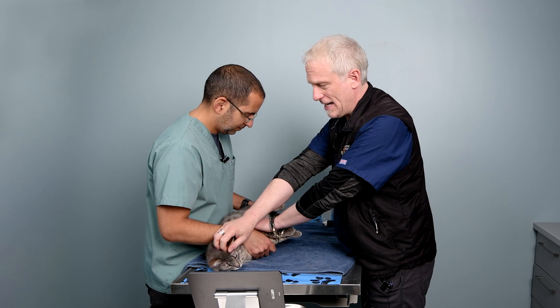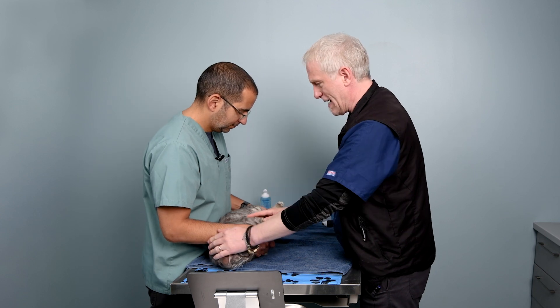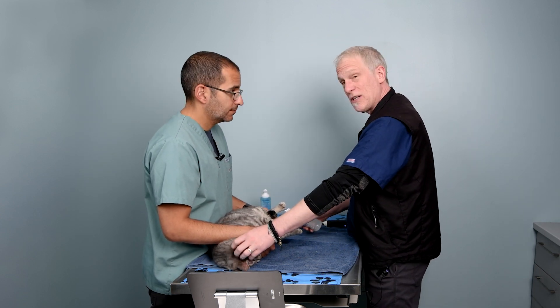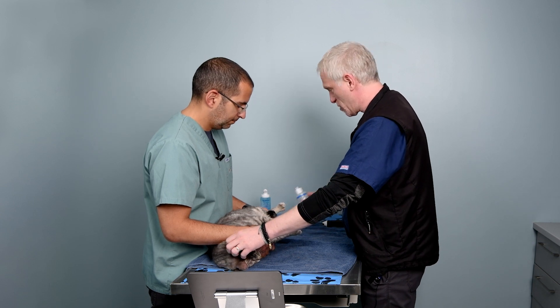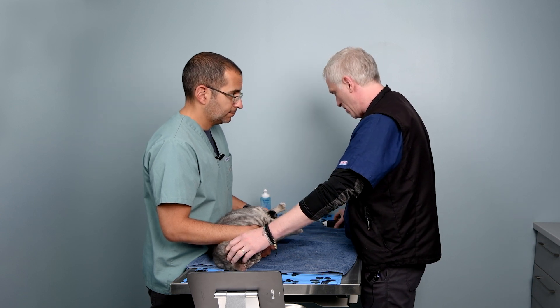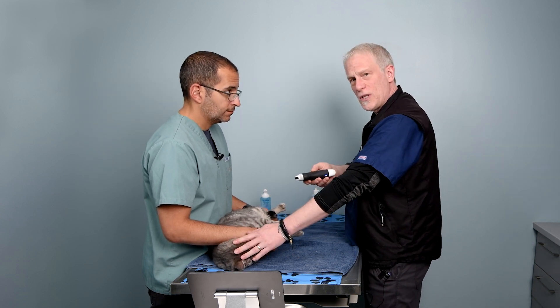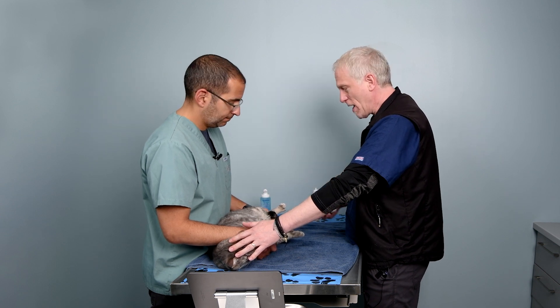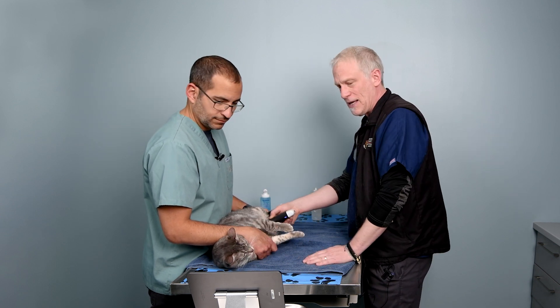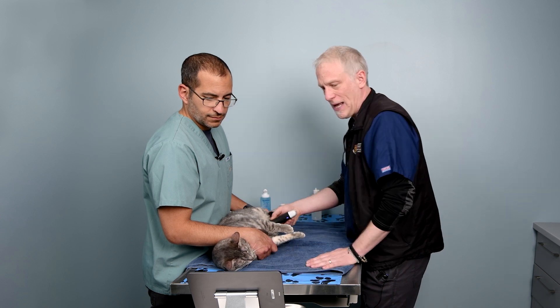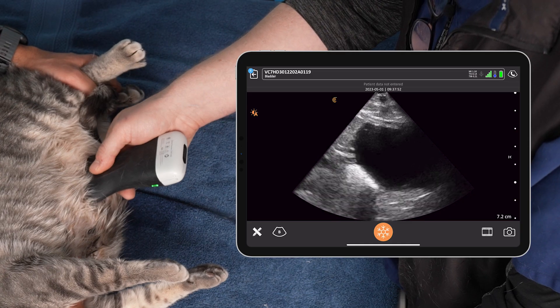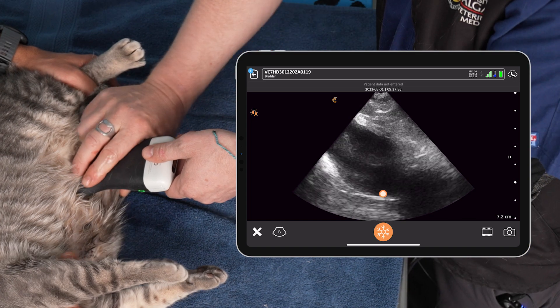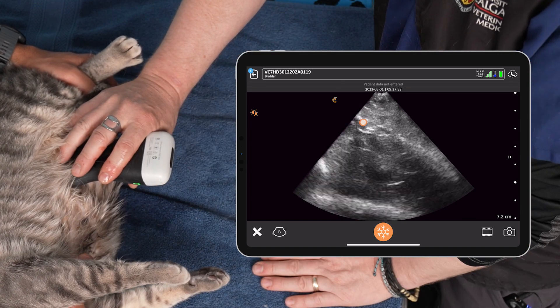The urinary bladder site is usually in the caudal region somewhere around the pelvis, but it can be challenging to find because we can have intra-pelvic and extra-pelvic urinary bladders. We want to use the motions of sliding and sweeping to broadly cover the caudal abdomen until we pick up that urinary bladder. I'm placing the probe on now, sweeping caudally — and there we go, I can see the urinary bladder in my window.